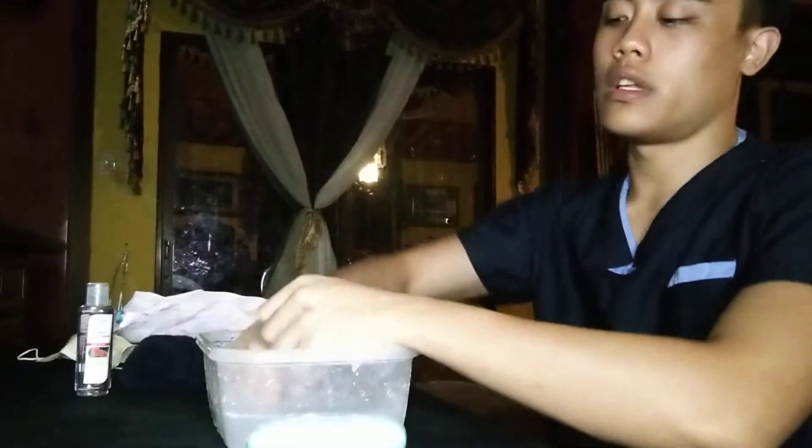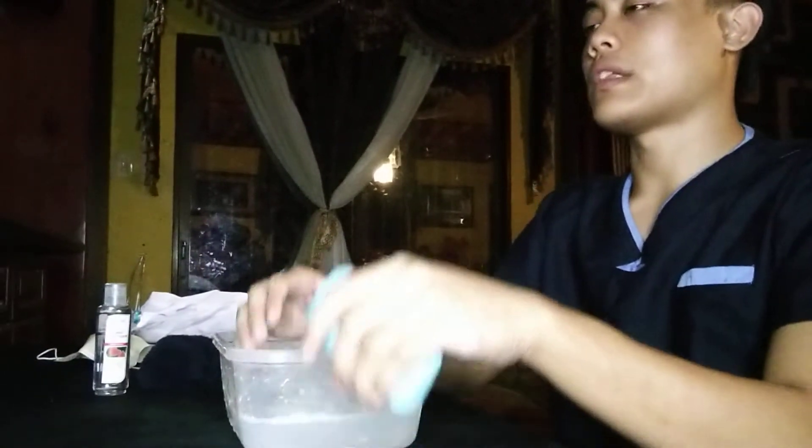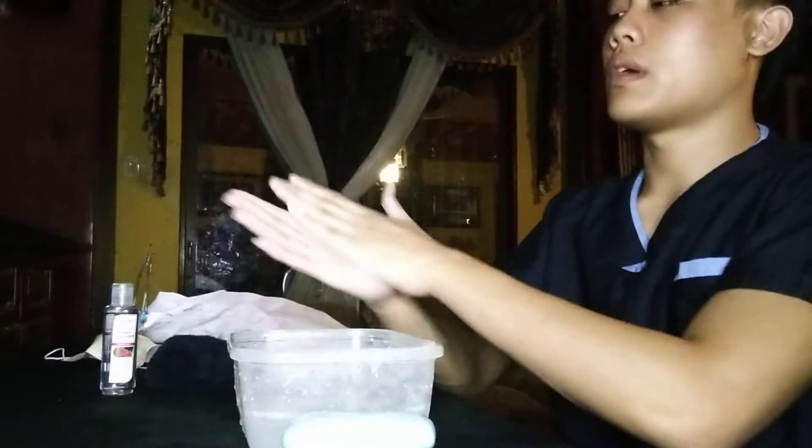Hand washing. First, wash your hands thoroughly with warm or running water. Second, put the right amount of soap on your hand surface. Third, do a palm to palm rubbing.